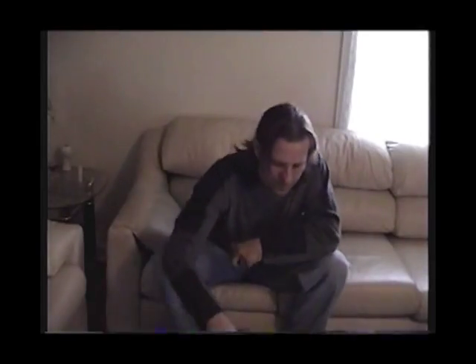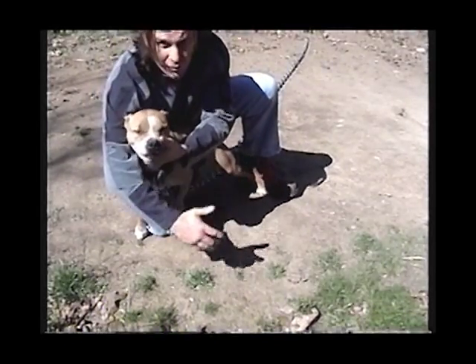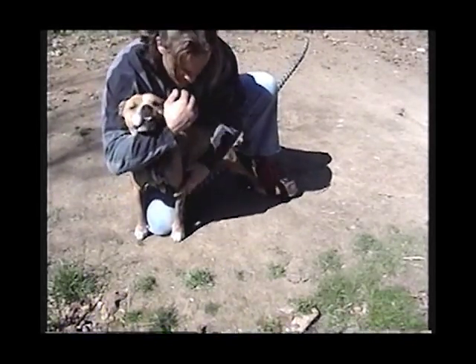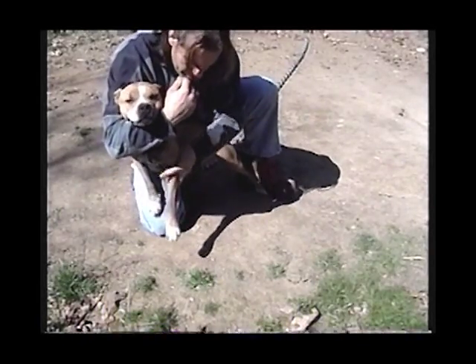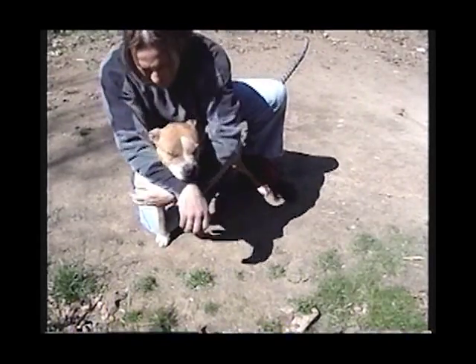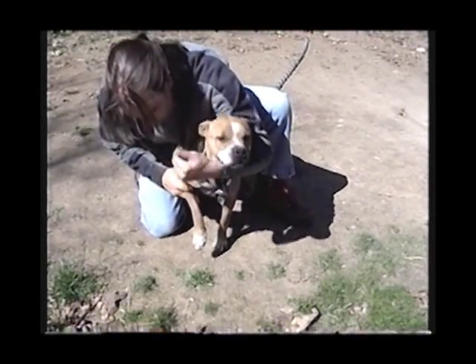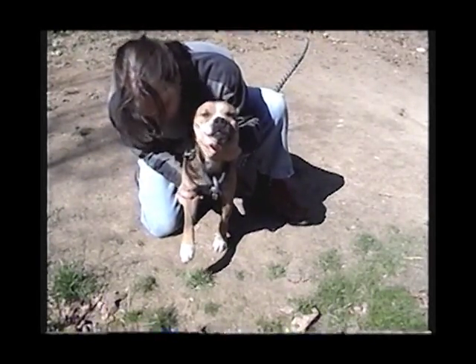Have this on hand before you draw the blood so you have something to stick it into. When you have a bitch and you want to draw blood, if you need a second, hold her head up and hold her arm out so that you can use the arm. If you're right-handed, you use this arm; if you're left-handed, have the second hold it and stick this arm out.